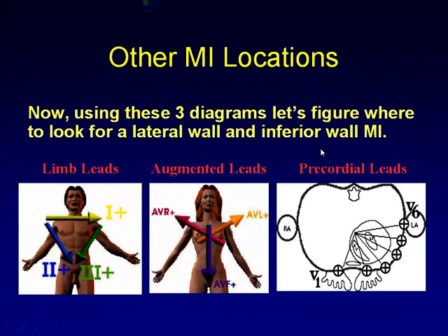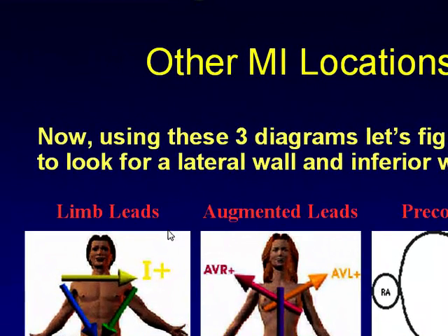So you have to look very well at the ECG paper to tell where the myocardial infarction is. Actually, on the ECG paper, the AVR is different from all these leads, and we can see it is opposite to them. Every wave on it is opposite because it goes opposite to the electrical current of the heart. It is the only one which goes in a different direction from the electricity. As we know, the SA node is here and the current goes down to here, but this lead is going opposite to this electric current, so it appears different on the ECG machine.